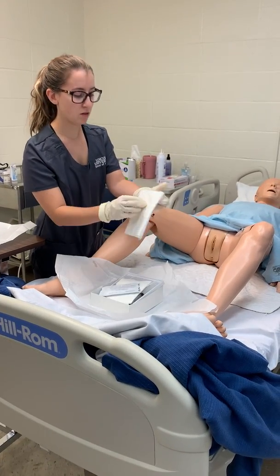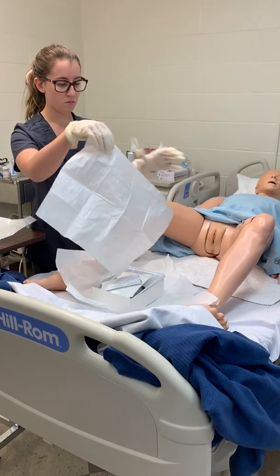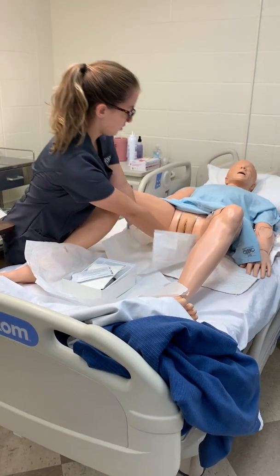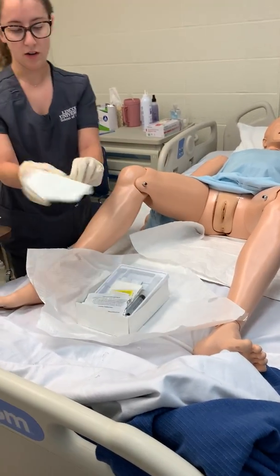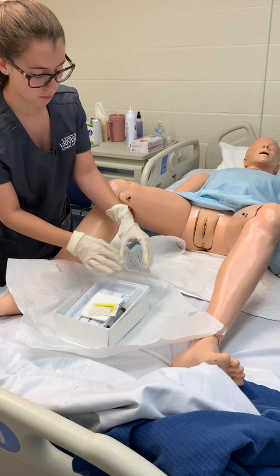I'm going to go ahead and unfold my sterile field area. Place it under the patient. And I'm going to go ahead and discard of that because I won't be using that for the female. Get my swab sticks ready.